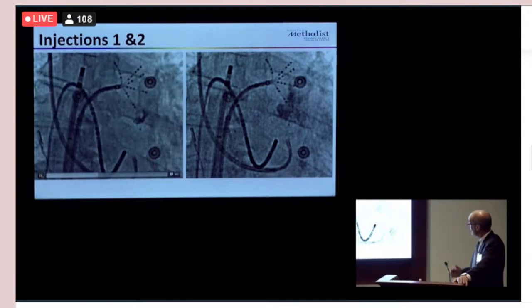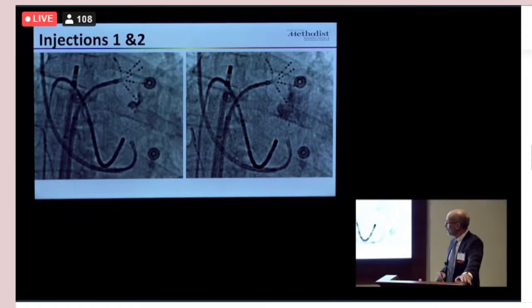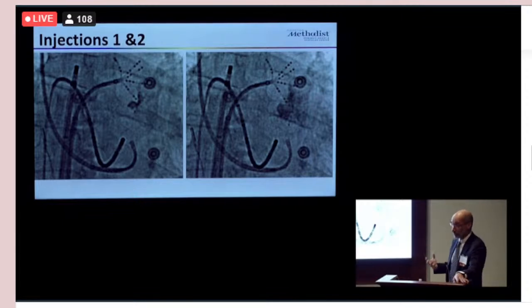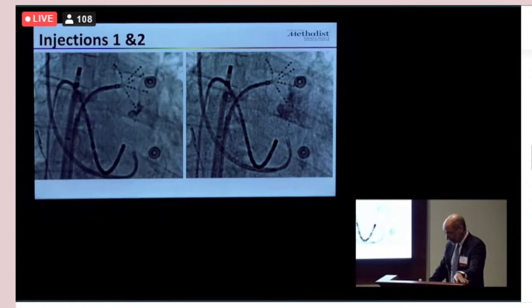And we inject contrast. I like to inject contrast first without inflating the balloon. When you have it as distal as that is, the vein of Marshall can be very, very frail. And remember that what you want is to preserve the vein of Marshall and its connections with capillaries and the tissue. So if you dissect it, you may get staining, but if it doesn't get to the tissue, then you don't get the ablation effect. So this is the first injection. You have some staining there.